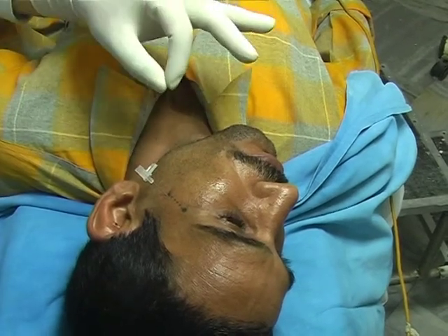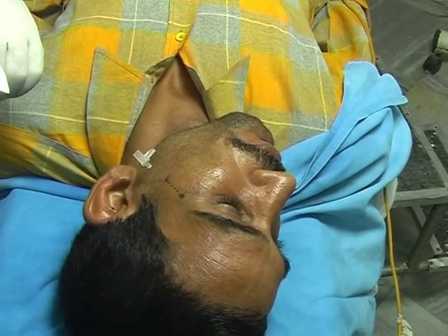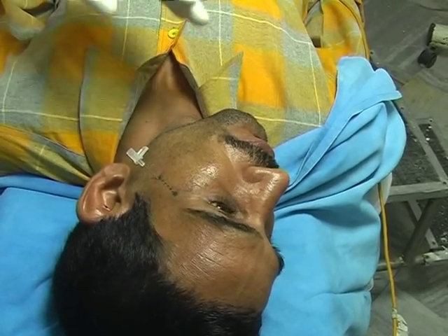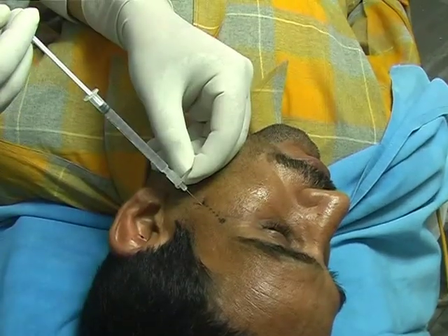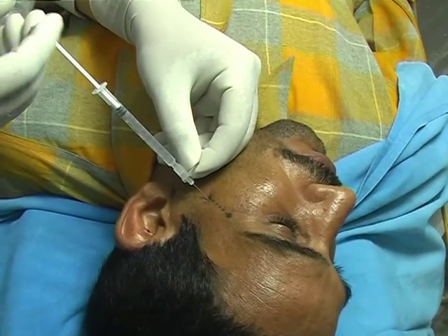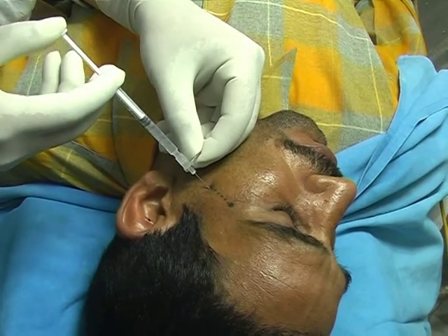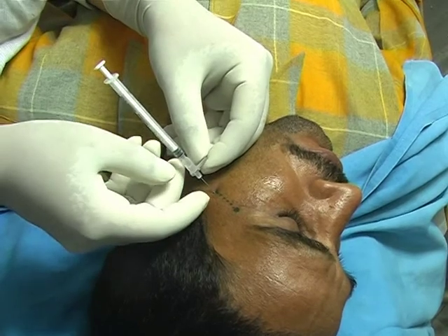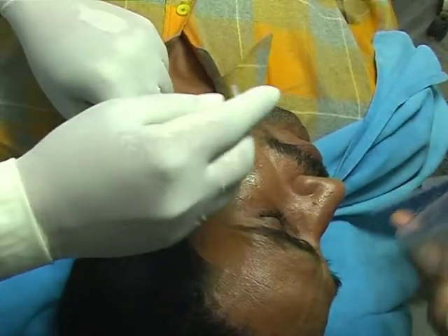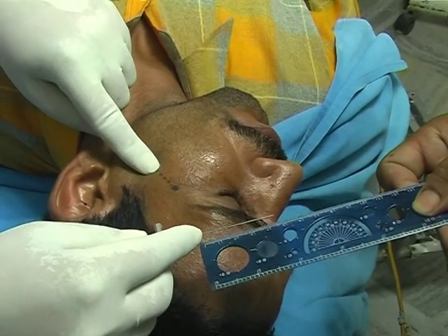The needle is in the proper anatomical plane. Now I am using pure rectified alcohol to block this pterygopalatine ganglion nerve permanently — permanently means at least five to nine months. Aspirate and check, then I am injecting one ml of the solution — aspirate and then inject again, aspirate, and remove the needle. The amount of needle I have inserted in this patient is about four and a half centimeters with a 22-gauge needle.